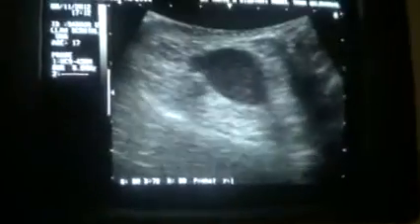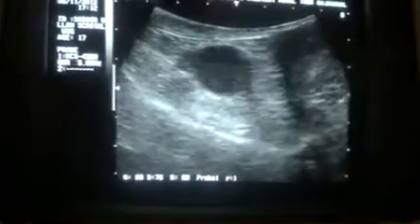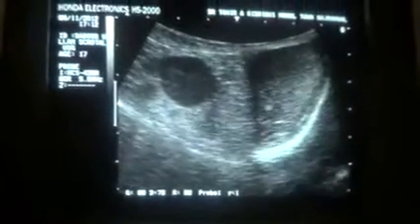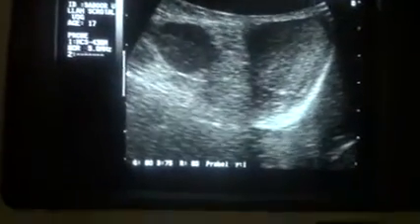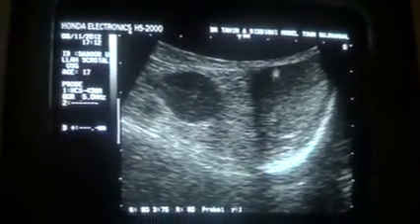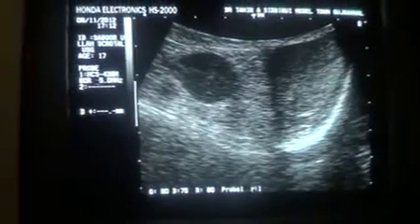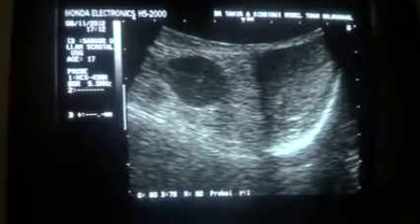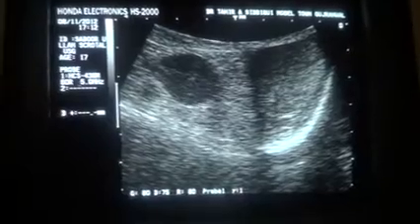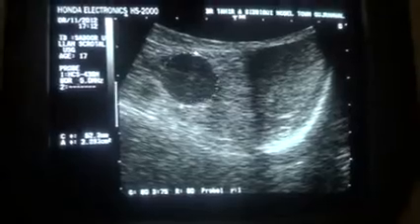Up to this point, we cannot comment on this very possibility regarding the hypoechoic area that is seen in the right hemiscrotum with no testicular tissue seen in this region. This is the left testis. This is the left hemiscrotum. This is the scrotal wall. Now this is the right hemiscrotum. There is no testicular tissue of this sort seen in this right hemiscrotum. In its place, we see a well demarcated hypoechoic area.